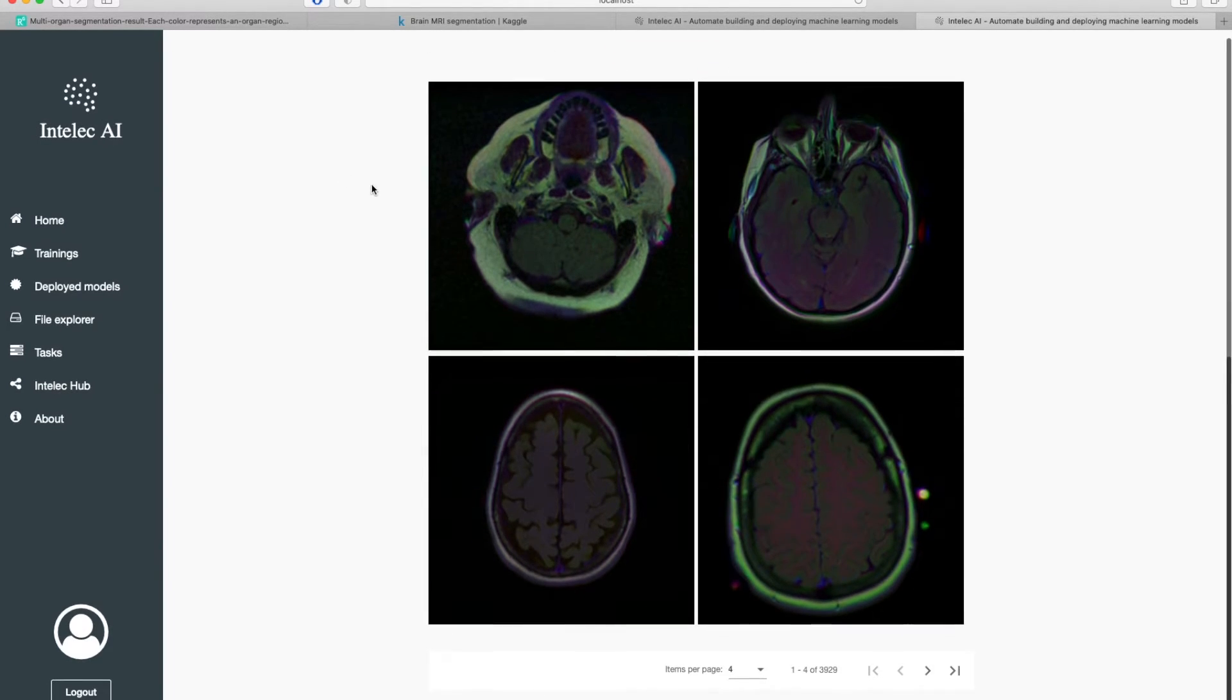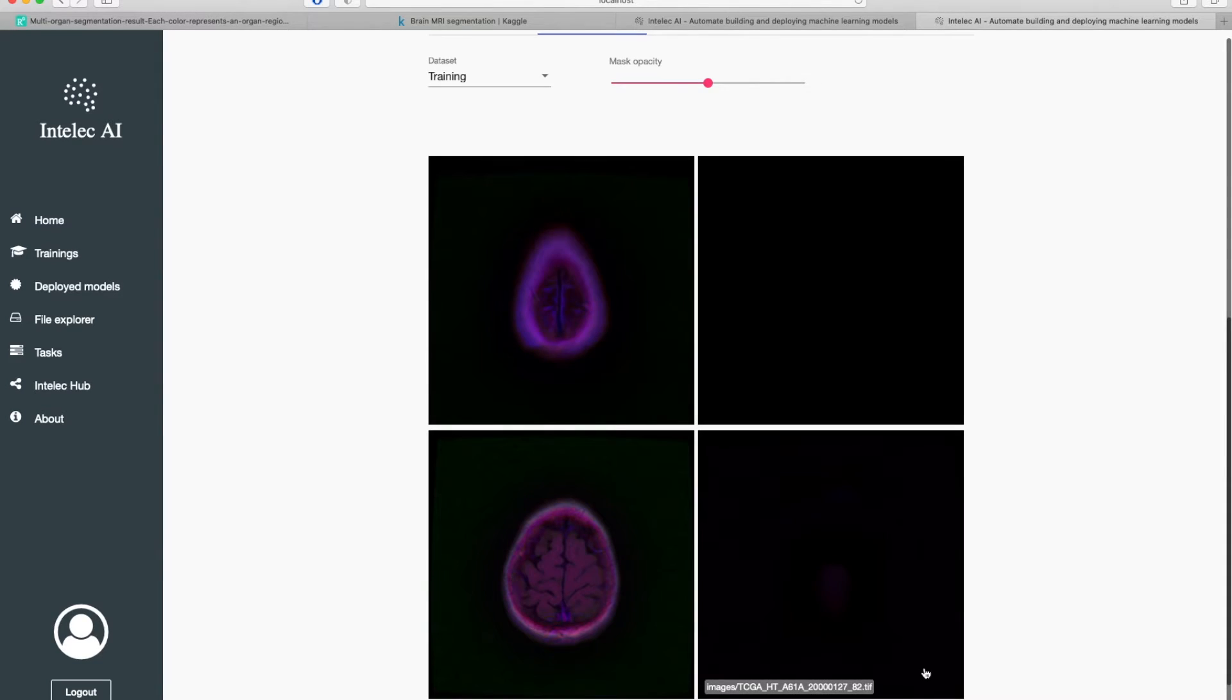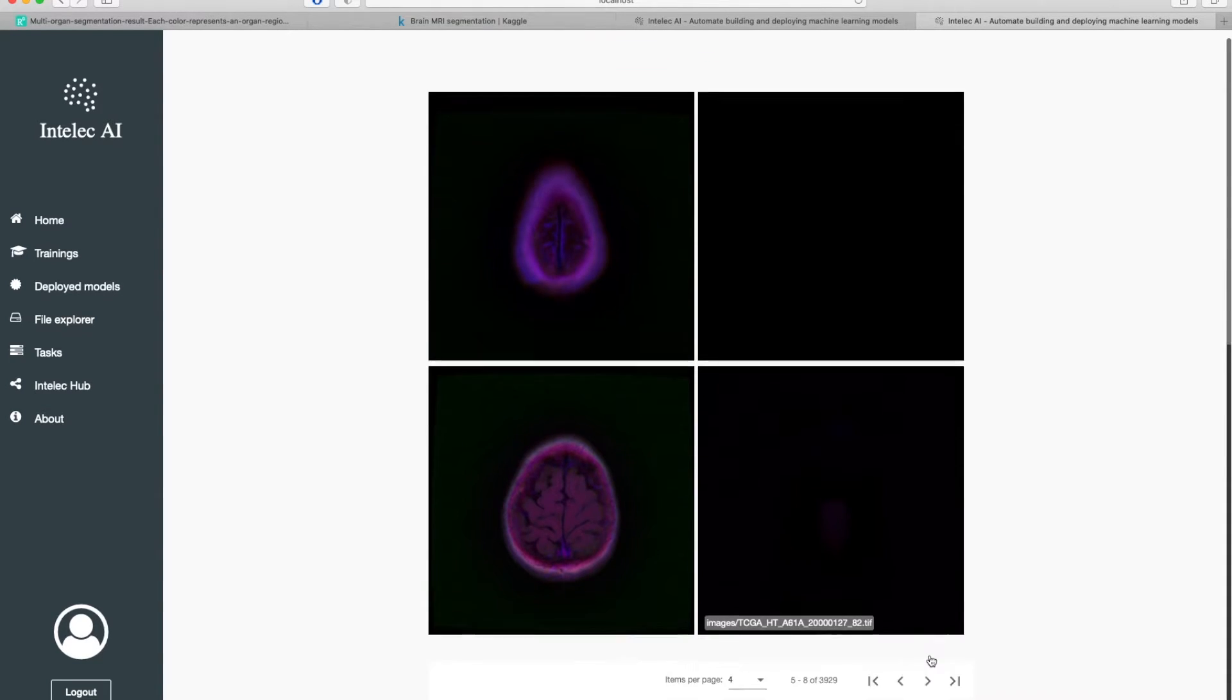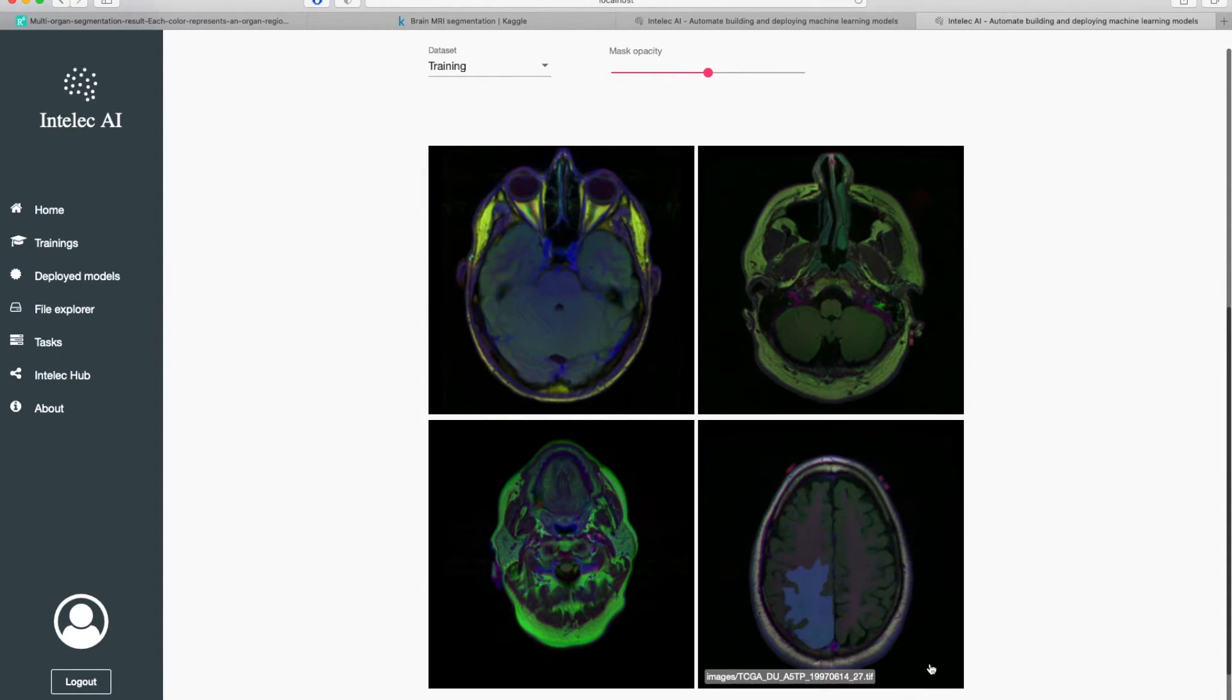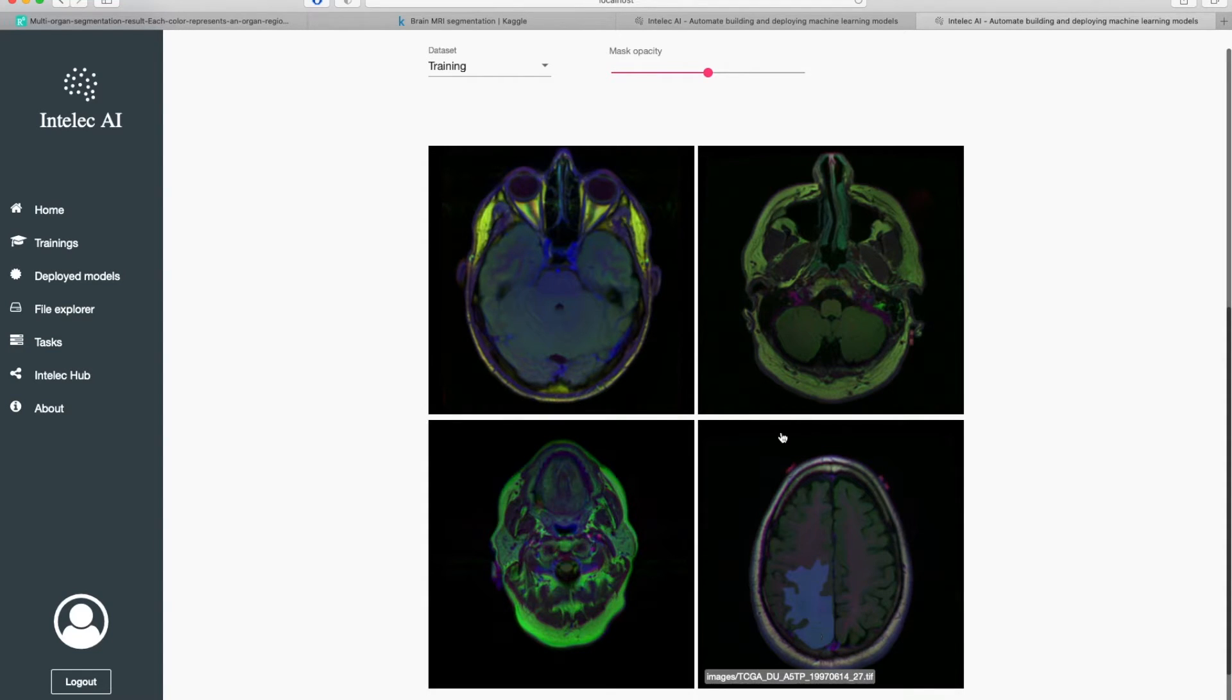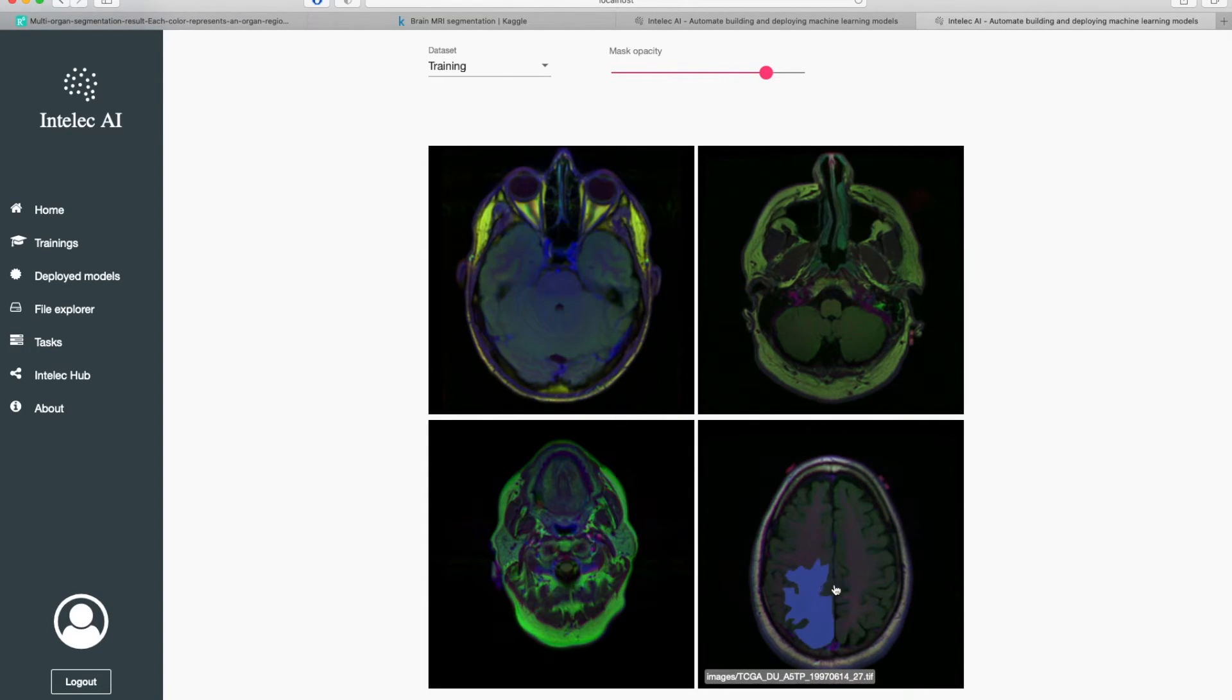Here you can go ahead a bit more. Here you can also see the masks. The opacity of the mask you can increase or decrease. You can see here that it increased.